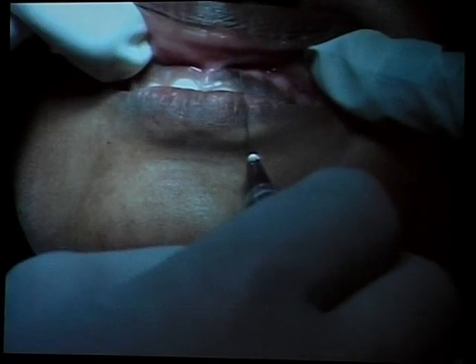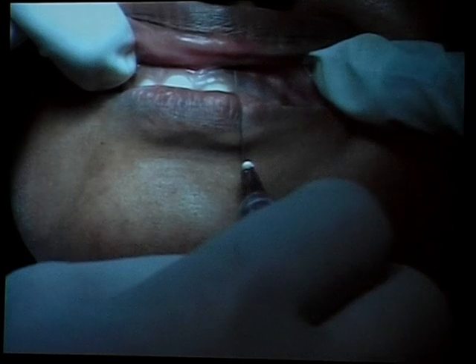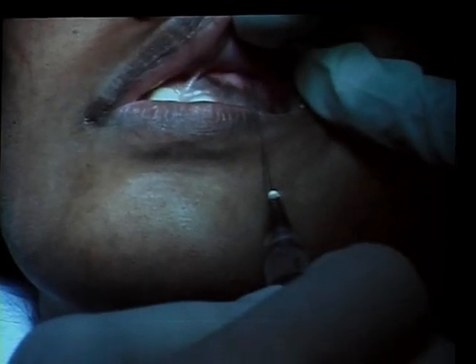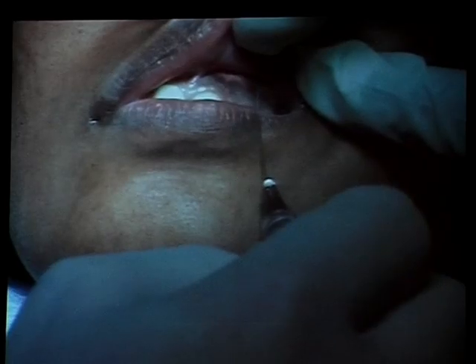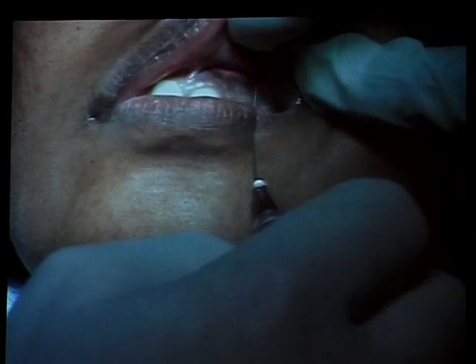If you are experienced, you know what powers you have to use, and you have to think about it. So as I did before, I said normally I would do 3.5 watts in Europeans, but only 2.5 watts here because of the much better pigmentation of the gingiva. So there's a better absorption because of the better pigmentation, and I need less power.